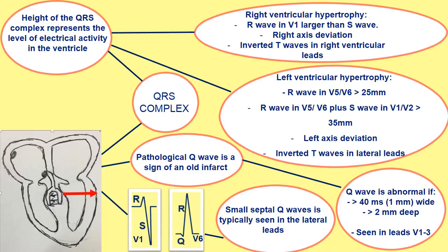Okay, now left ventricular hypertrophy. You get long R waves. You get left axis deviation, because there's so much muscle on the left side. Now the wave of depolarization is even pushed further to the left, and you get long R waves, because if there's so much muscle there, then this wave will be massive.